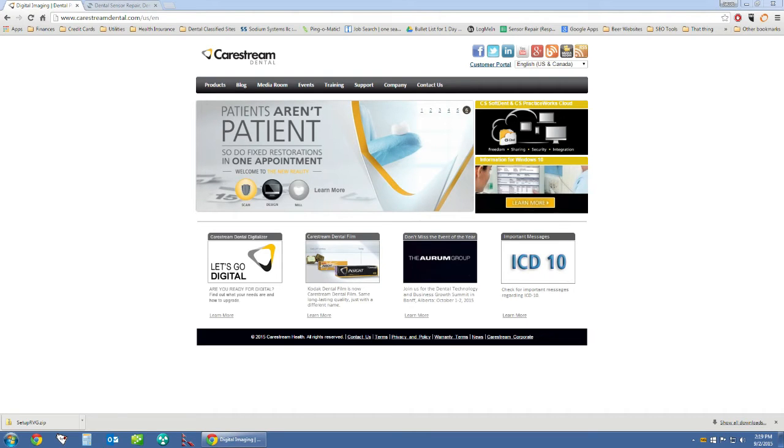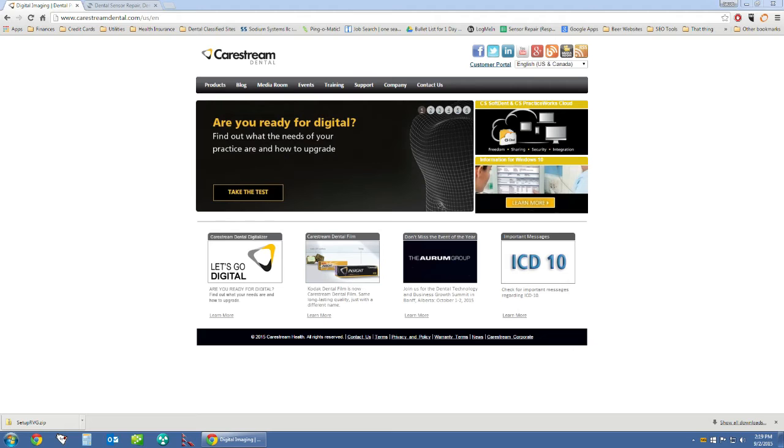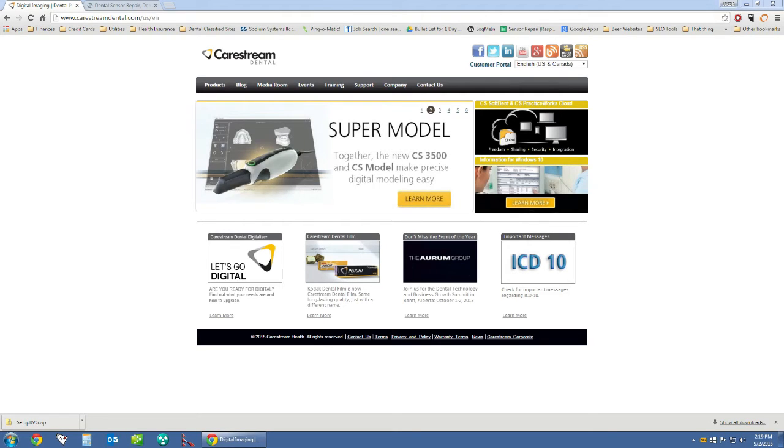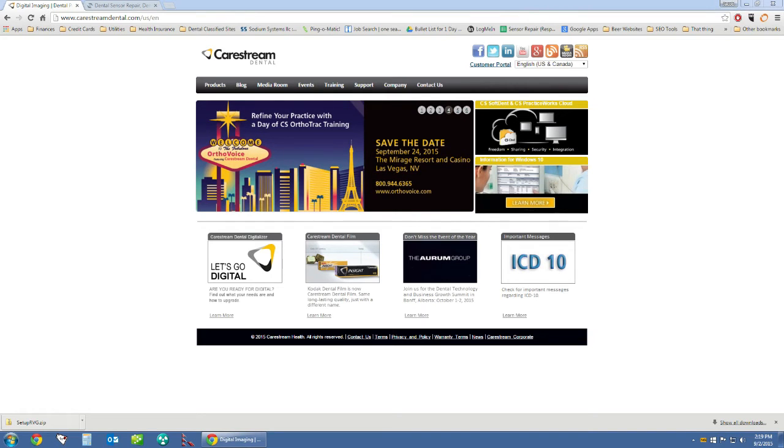Thank you for visiting the Sodium Dental YouTube page. In today's video we're going to cover how to install the Kodak RVG 6100 dental x-ray sensor onto a Windows 7 machine and how to integrate it into the Aptrix X-Ray Vision imaging software.